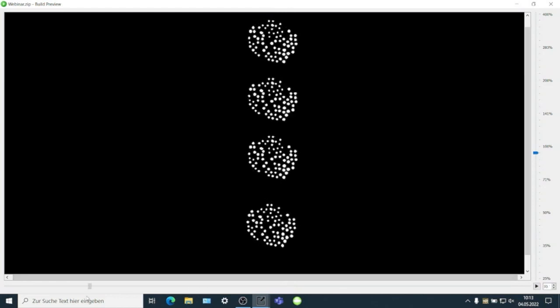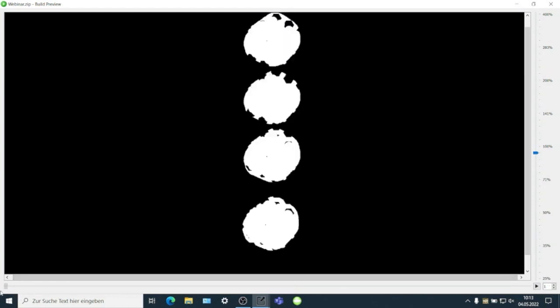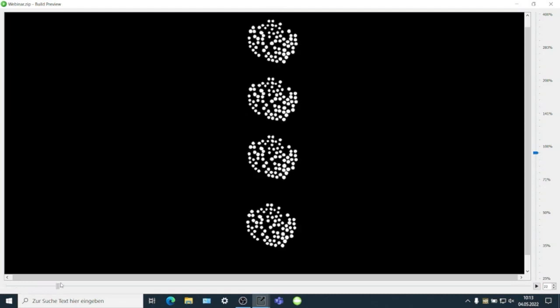So the interesting point is here at first, the first layer must be stuck or must be built on the platform. This is layer number 1. And the next critical situation is here, if the crown started, it must be connected to the support. You can see it here in this area.